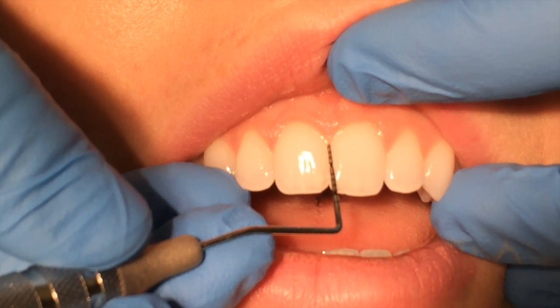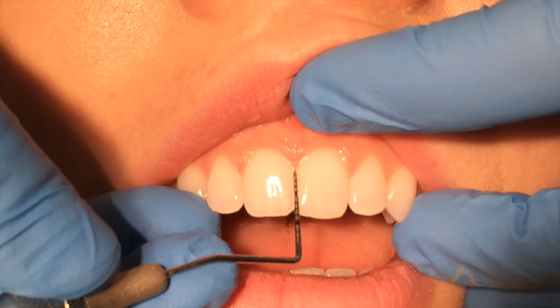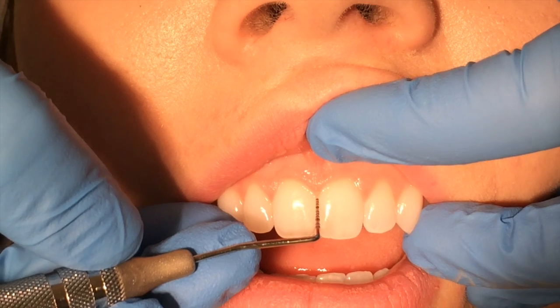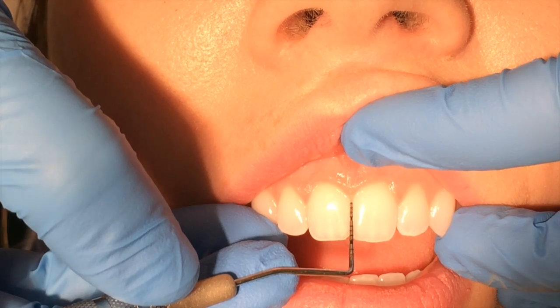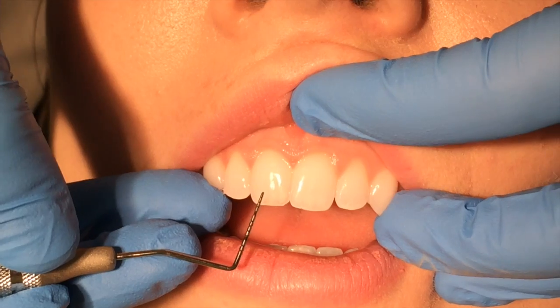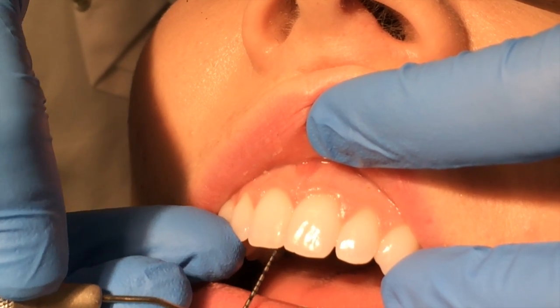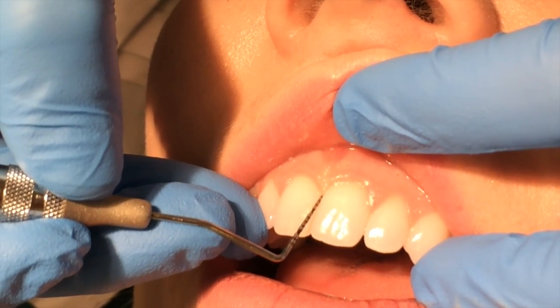This is where a lot of clinicians have a hard time as you enter the interproximal space — this is where access comes into play. Too often, clinicians are tilting their probe perpendicular to the tooth instead of making it just about a 10-degree angle to access that col. One thing that helps remember what a 10-degree angle looks like is imagining a clock and thinking about five after. So if this was noon, you would just want to go five after and access that col.